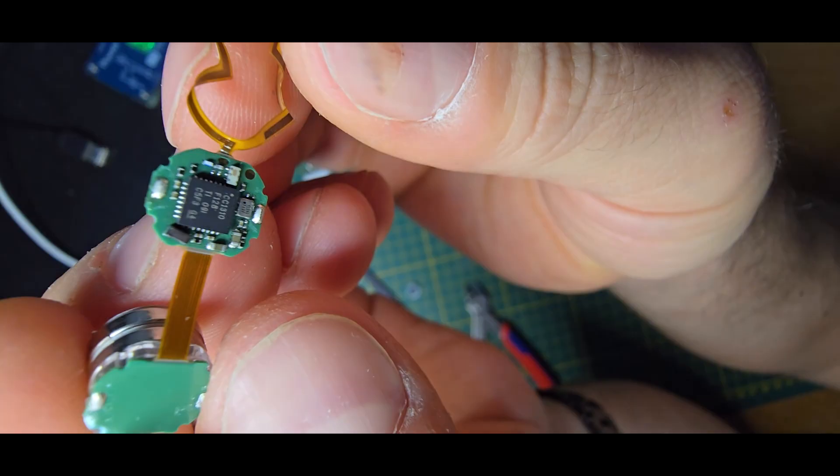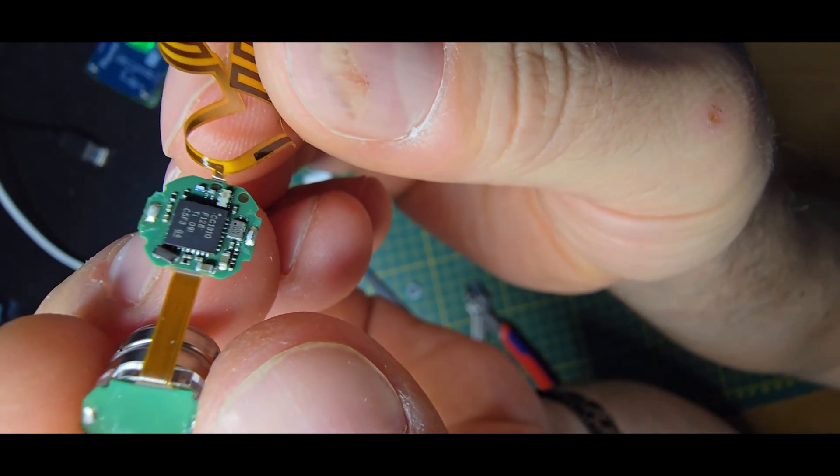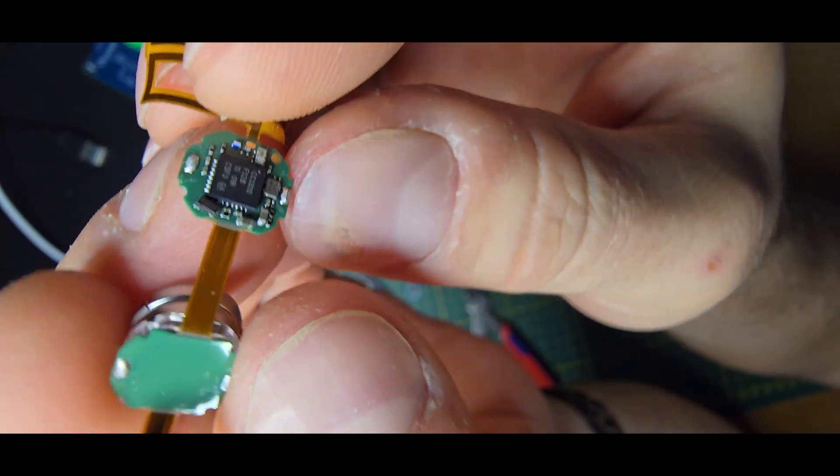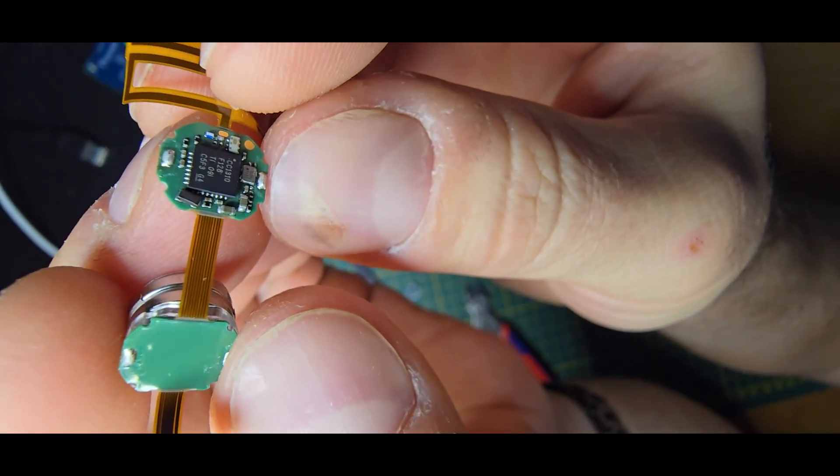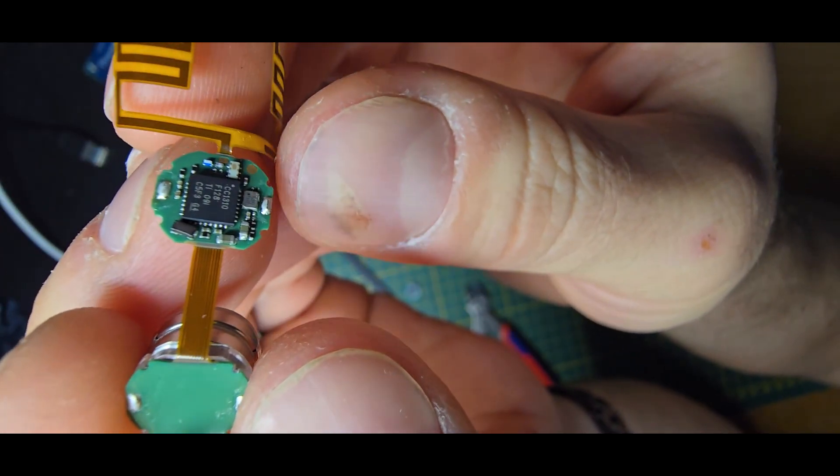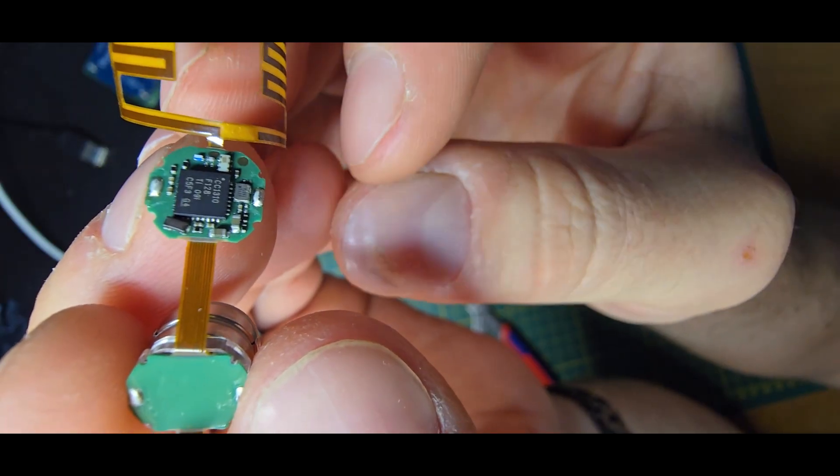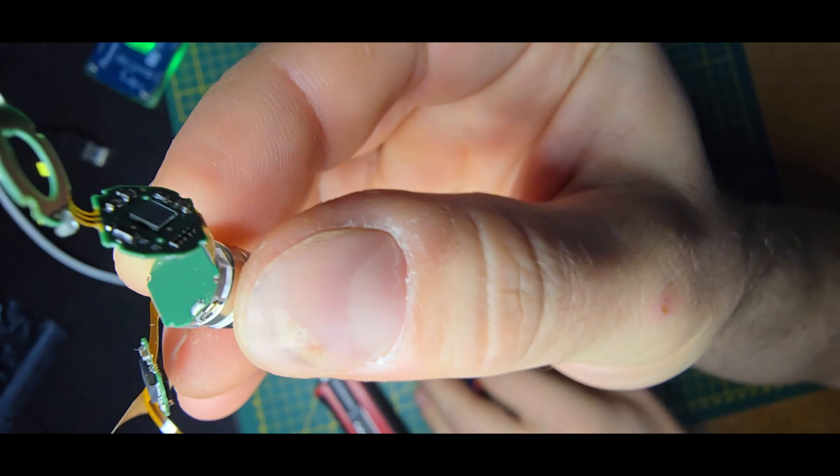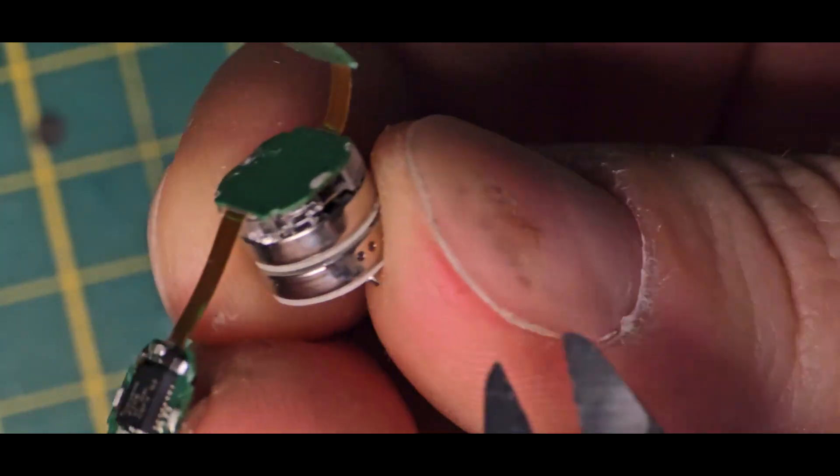The CC1310 is the RF chip, and this is also like sub gigahertz, so somewhere around 400 to 900 megahertz. And yeah let's also open this PCB up. And zoom in again to make it simpler.